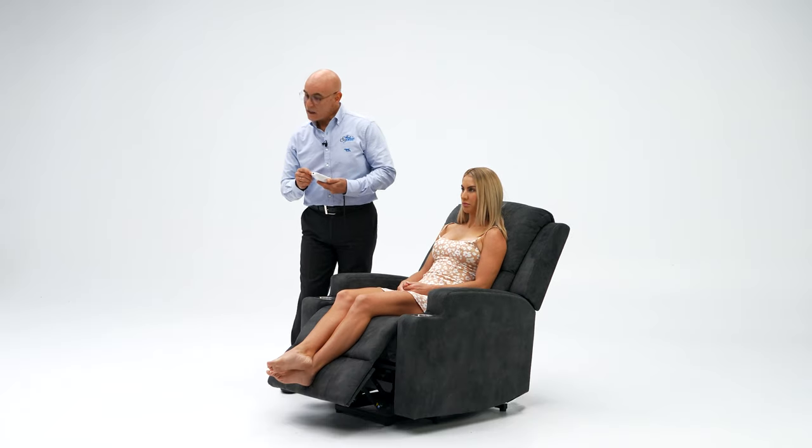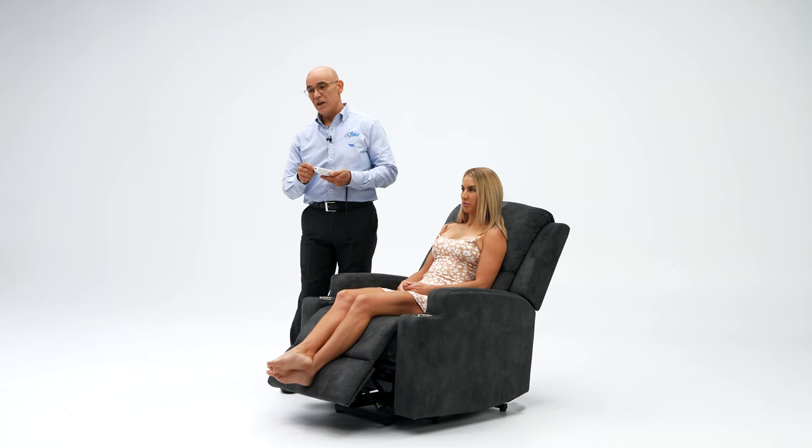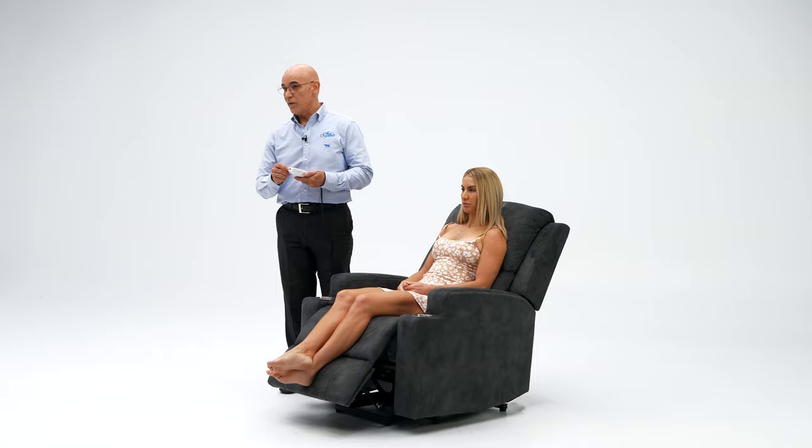On the remote control you can see it has a USB port so you can have any device charging there, like an iPad or your phone.